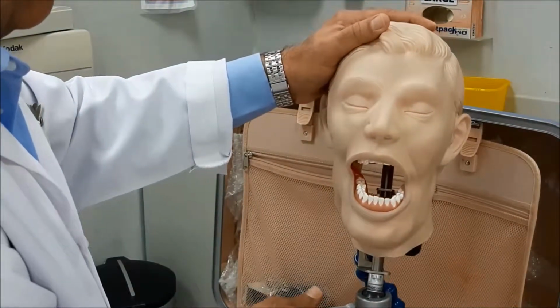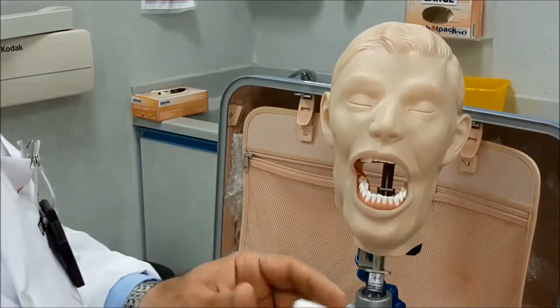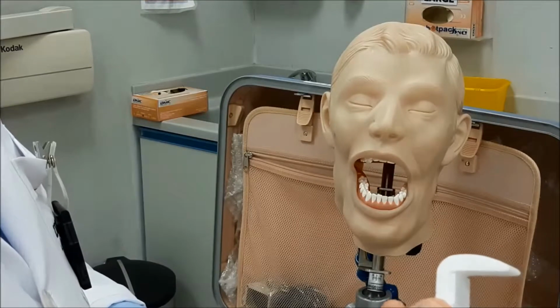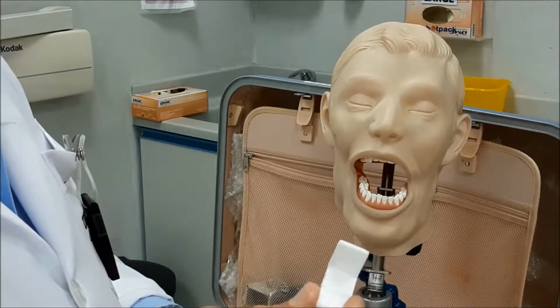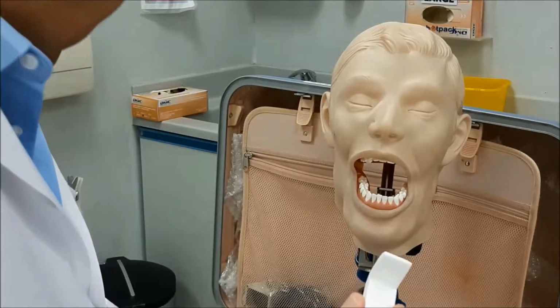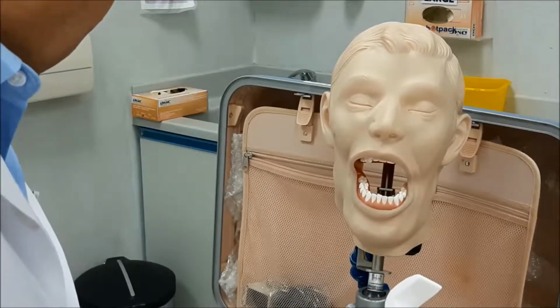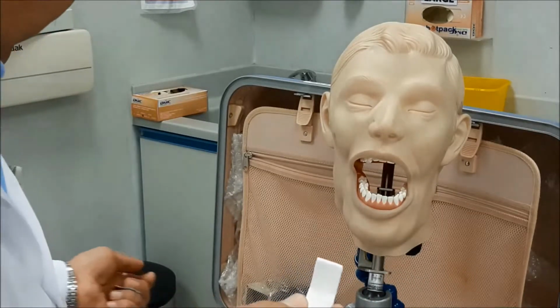When it comes to other forms of sensors, there is another sensor which is the bite block sensor. This is a sensor that is made from styrofoam, and it is much easier to use, and it is disposable, very light in weight. This can be used with the PSP sensors, and it can be used with the size 1, size 2 films, so it can be used for small mouths, small for children, and it can also be used in adults, the size 2 film.